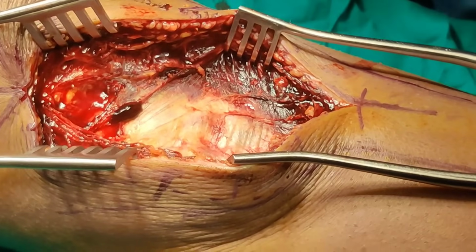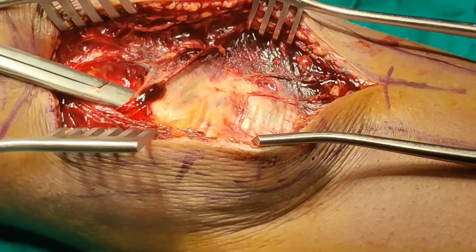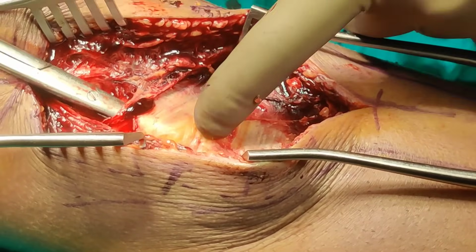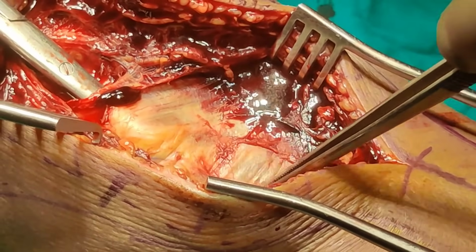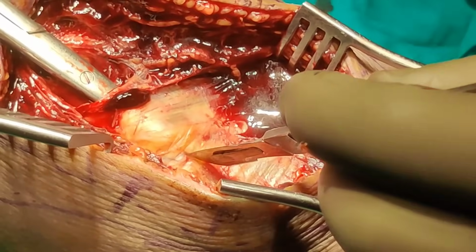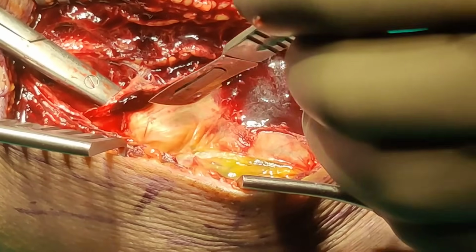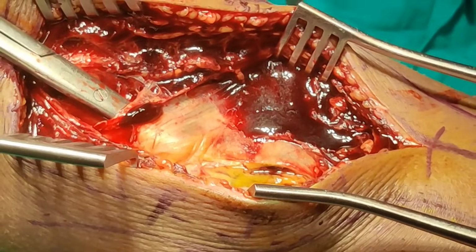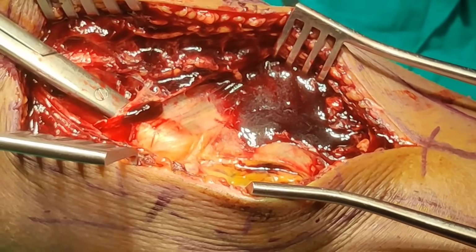If I can have my dissecting scissor just to show you, this is the pes. Now your plate has to go deeper to it. So I can see the lower part of the pes, the tendinous part is here, and everything else is just the fascia. So I'm just going to open this fascia right onto the bone and see if I can create a tunnel. Or the other option is you can skeletonize, you can identify the tendons and then try to mobilize it. However, if it is coming in your way, then you can just cut it, tag it and repair it once you have put the plate.